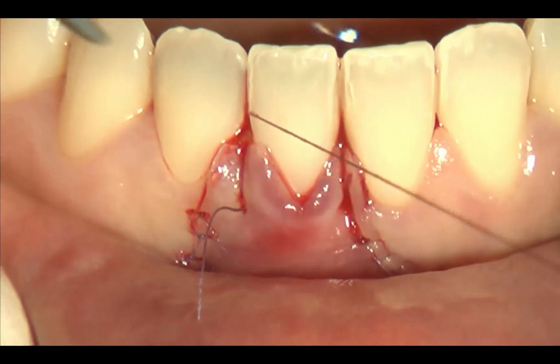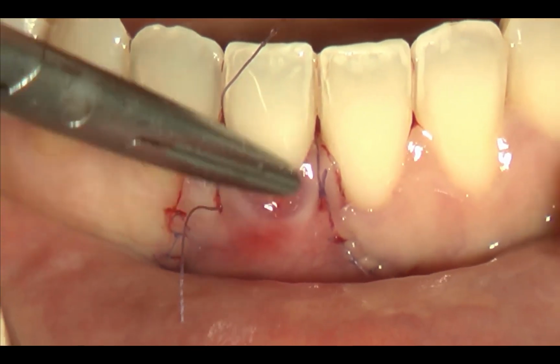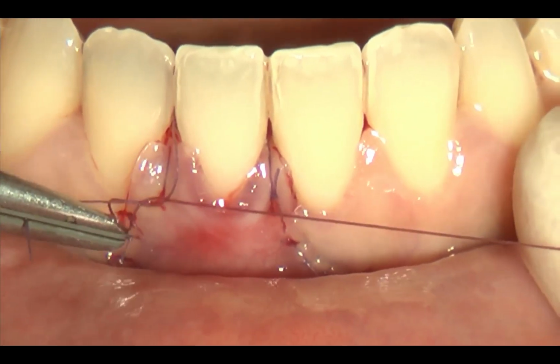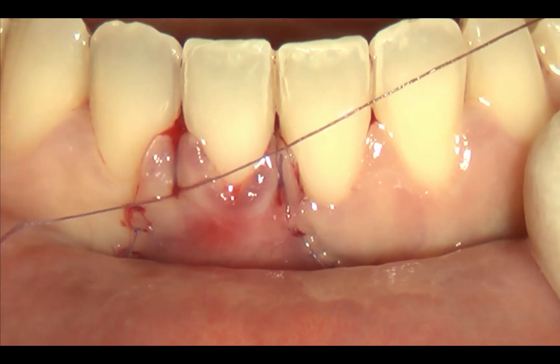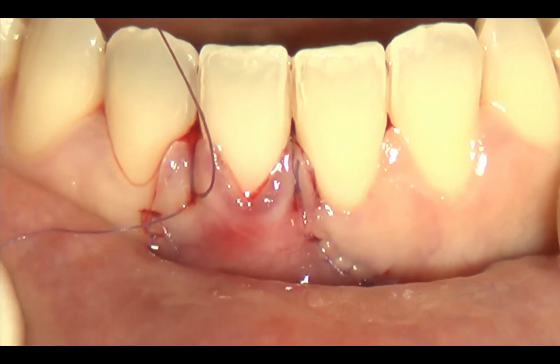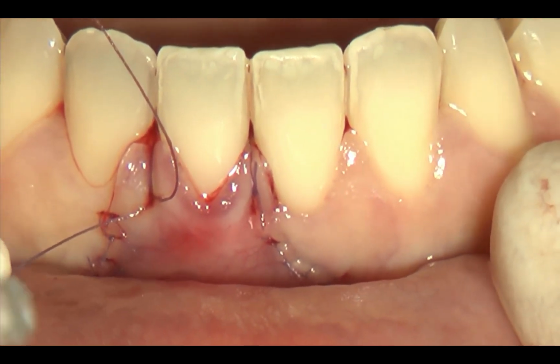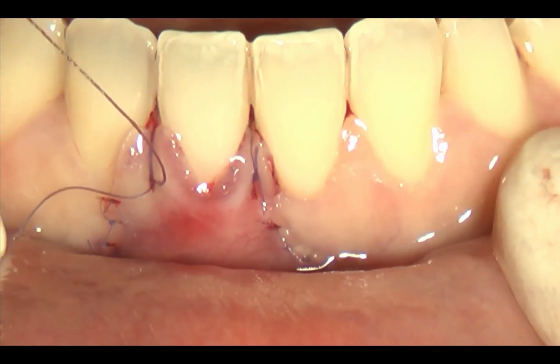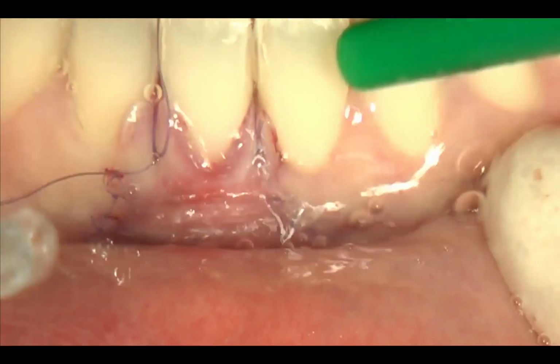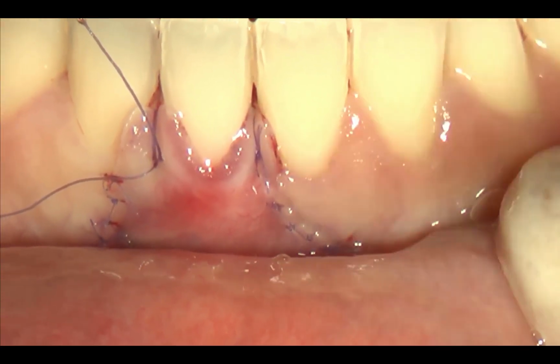I have to see that there is no more bleeding from the soft tissue margin, so I check for this and I close it. Now saline, the physiological, and I have to check that once this coagulum is being removed from the soft tissue margin, there is no other blood coming out.